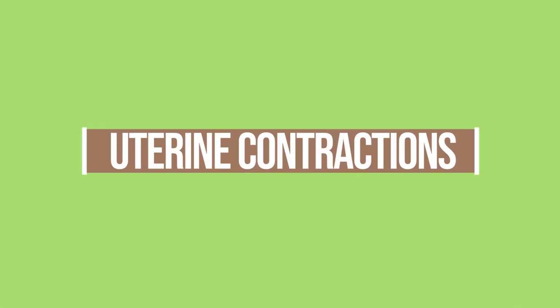The fourth variable is uterine contractions, and how does that relate to my baby's heartbeat rate and acceleration or deceleration. When you have a uterine contraction, almost all babies' heart rate goes down a little bit. If the heart rate goes down with the contraction, that's not a concern. That simply means that the baby's head is being compressed.